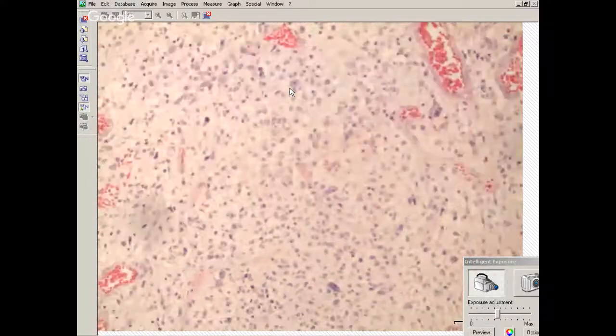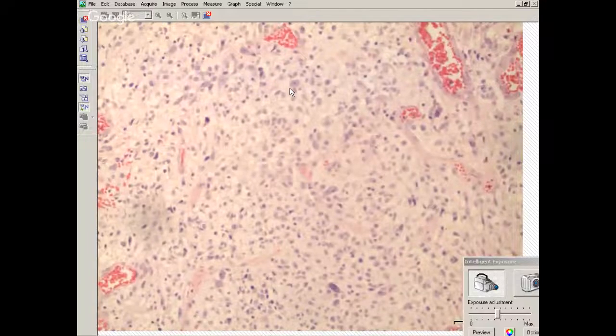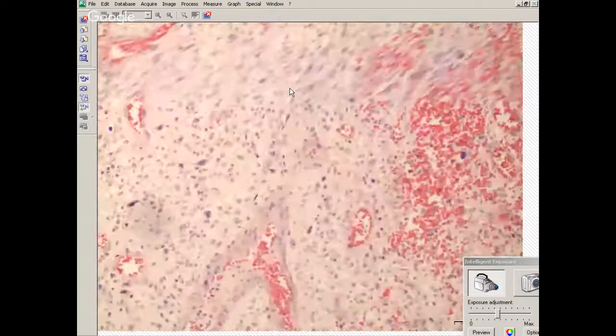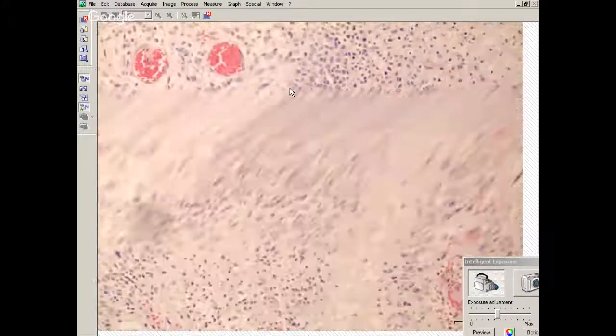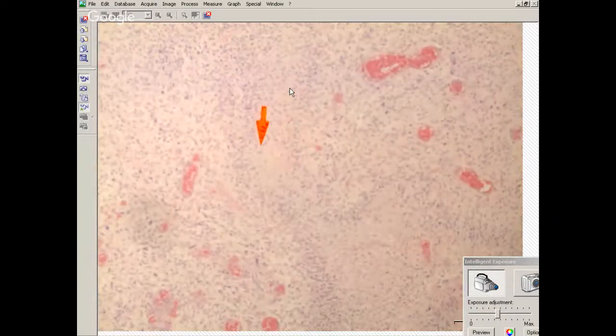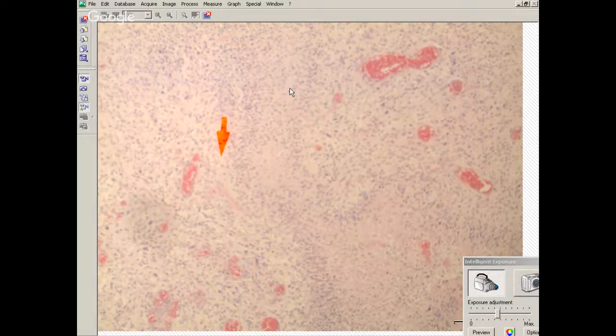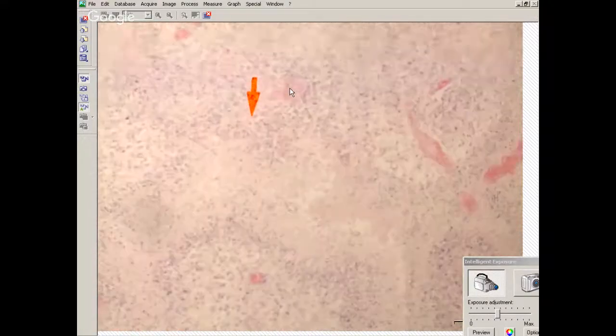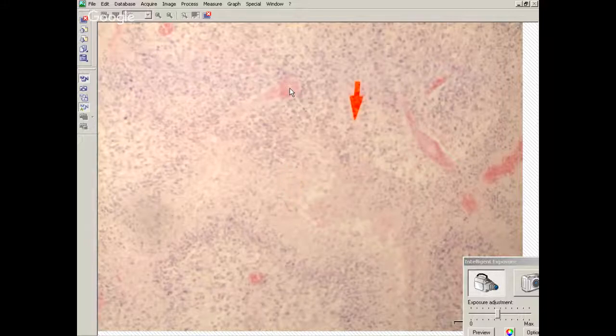In this case, it looks very glial. The cells are very pleomorphic. They're fairly variable from one to another. So this is a GBM. There's probably going to be areas where there's necrosis as well. Let's see, we have pseudopalisading. Yeah, so we have pseudopalisading necrosis as well. There's central necrosis here, and around the necrosis we have a dense network of tumor cells piling up around the areas of necrosis, so pseudopalisading necrosis. Even if you got this on a frozen section, you get pseudopalisading necrosis and these elongate hyperchromatic nuclei, by definition, it's going to be a GBM.